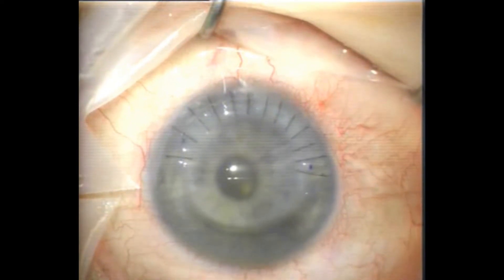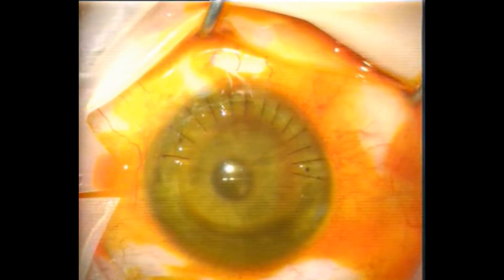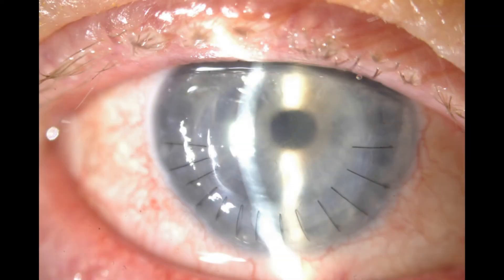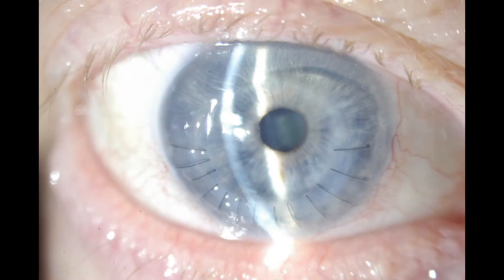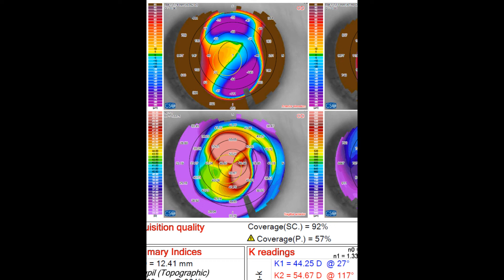Okay, again just checking with the surgical keratometer at the end of the case and it's reasonably circular. Checking for leaks with fluorescein. This is day one post-op and the patient was 6/15 unaided — he's already commenting on how his vision is clearer than pre-op. Still a bit of corneal edema and things will improve as that settles and sutures are sequentially removed. Here's day five post-op and the cornea is clearer and compact, and here's his post-op topography with quite a lot of astigmatism but it's fairly regular and should do well with suture removal.